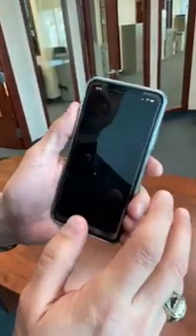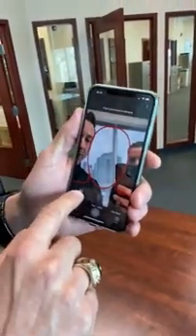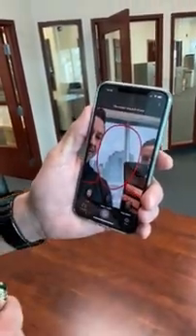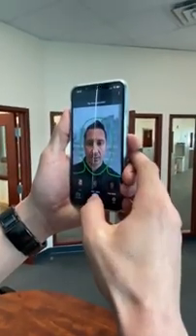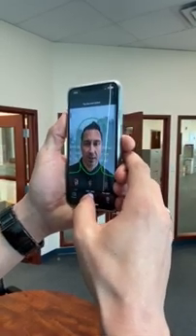The first thing you're going to do is open the Bellis 3D app. You're going to want to make sure you use only the face option, not face and neck. Hold it up straight so that it's in a horizontal line with your face. Once the box is green, simply click the camera button.